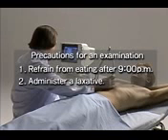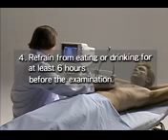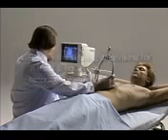If the patient is severely constipated, we may administer a laxative on the previous day. When the ultrasound examination is performed in conjunction with gastric fluoroscopy or endoscopy, ultrasonography must be performed first. This is important because the barium taken for examinations of the digestive tract coats the gastric and intestinal walls, making ultrasonography impossible. If it is necessary to carry out an ultrasound examination in the afternoon, the patient can have a light breakfast, but must refrain from eating or drinking for at least 6 hours before the examination.